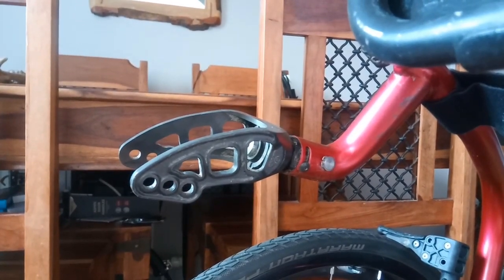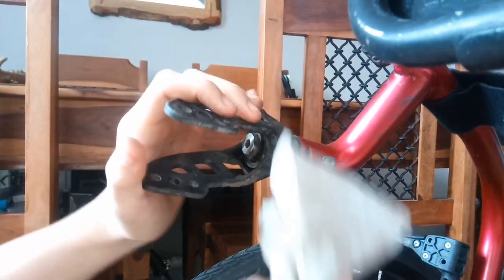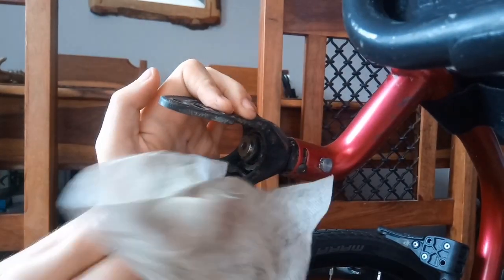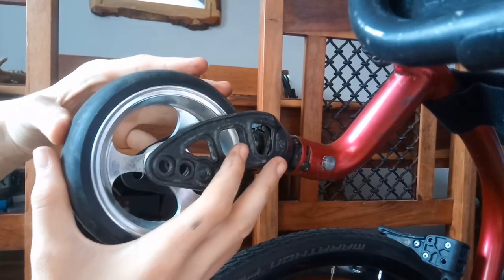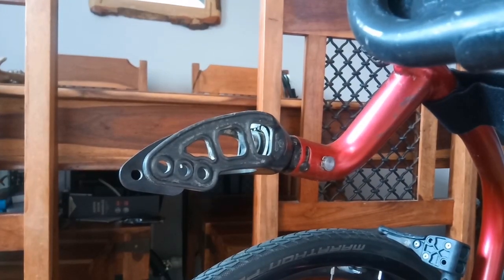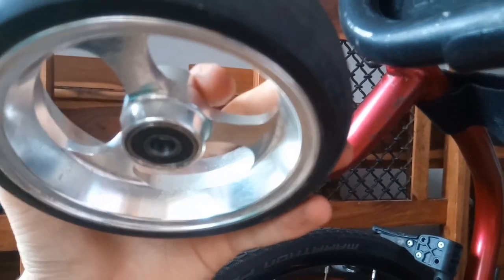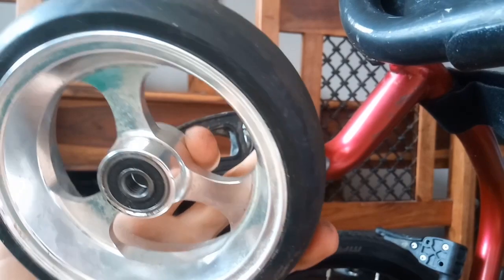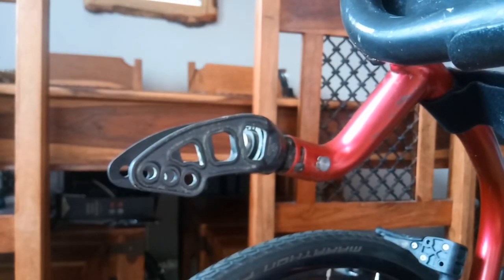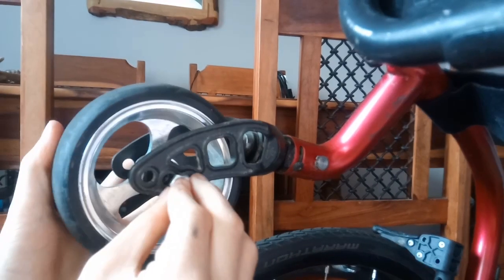Okay, so coming up quite close now to this thing, which I am still in the middle of cleaning. Just finished this off. So this is where the wheel goes. So it sits in there like that. Now, first thing you gotta do is work out the correct way to put the wheel on. Now, I don't know if you can see in there, but there's a small amount of thread here. Now, that goes on the inside, because remember the nut, or the bolt, this nut goes there.